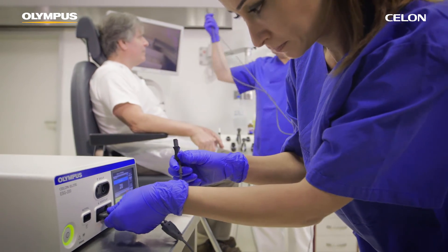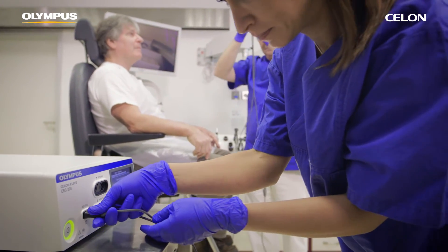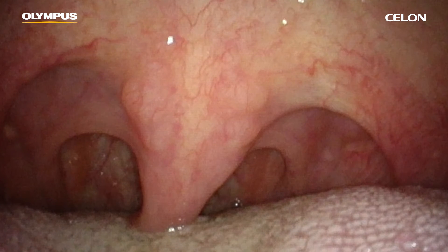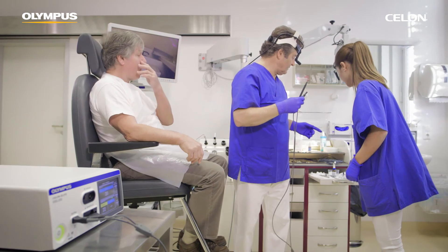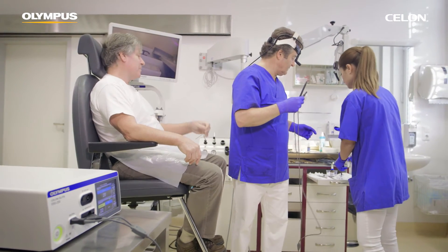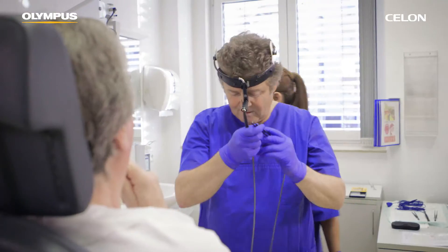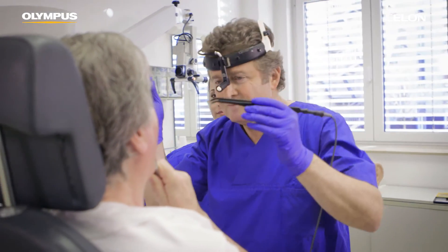Additionally, if you find pronounced webbing and significant hypertrophy of the uvula, this may indicate that a reduction of the uvula and the soft palate mucous membrane is necessary. If necessary, you can also perform radiofrequency-assisted uvula palatoplasty during the same treatment session with no additional risks.